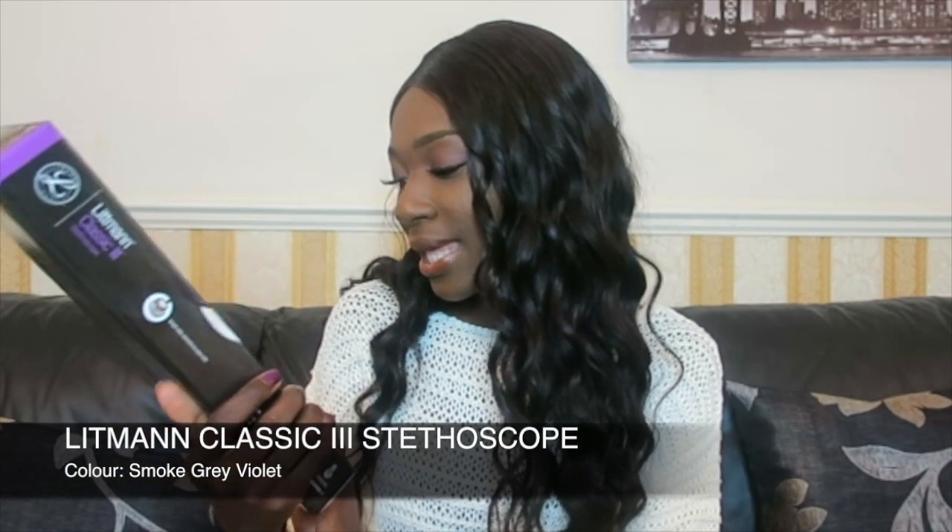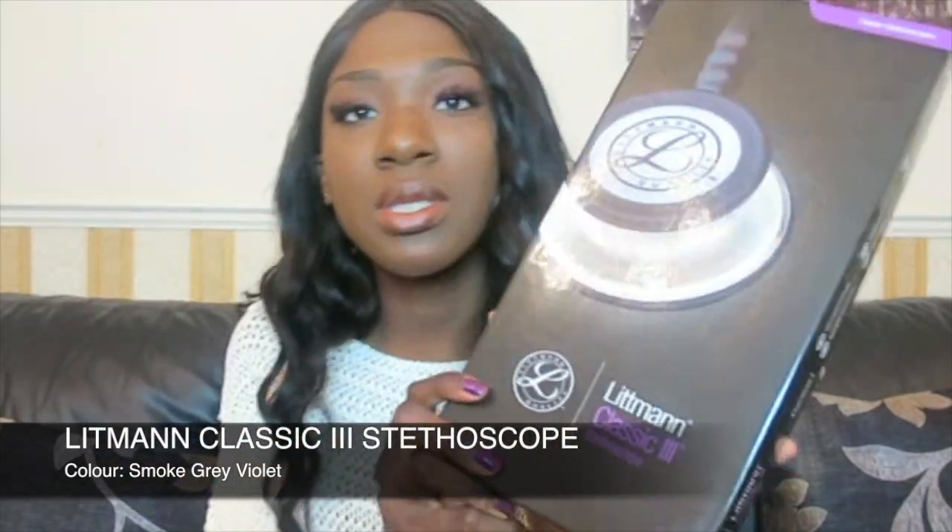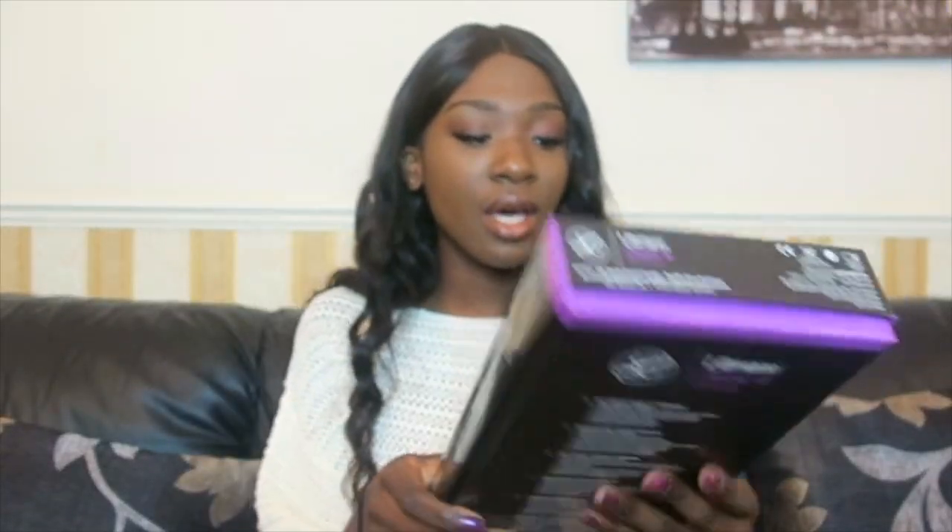I got this stethoscope about two months ago — it's the Littmann Classic 3. I've actually used this stethoscope for one of my OSCE exams, and it was actually pretty good. I went on the Littmann website first, and they had a link to several different websites where they sell stethoscopes, so I decided to get it from Medisave.